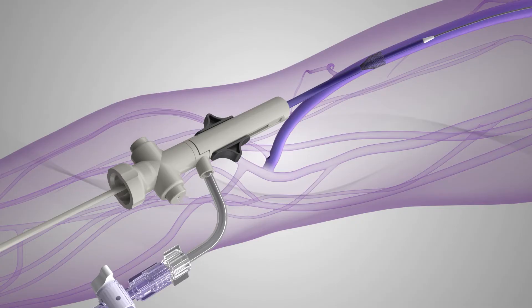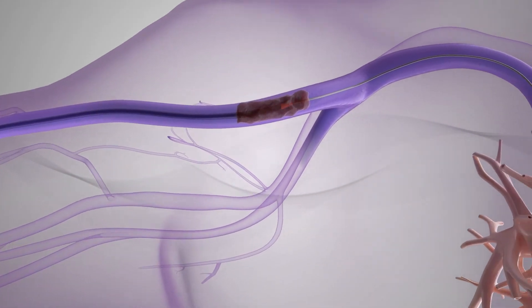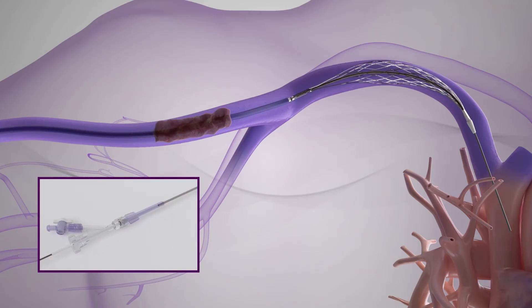Under fluoroscopic visualization, the Inthril catheter is advanced until the proximal element marker band is beyond the target thrombus. While maintaining the position of the Inthril inner catheter, the outer catheter is retracted to deploy the element using a pin and pull technique.